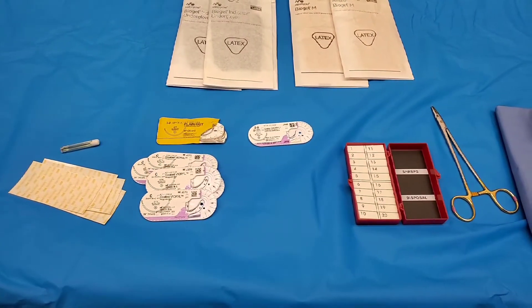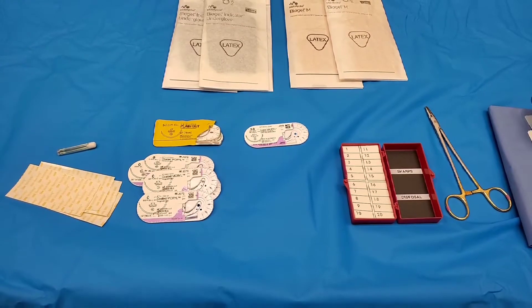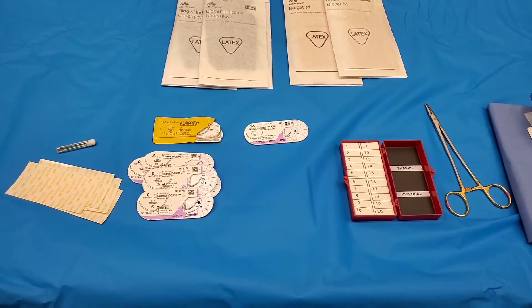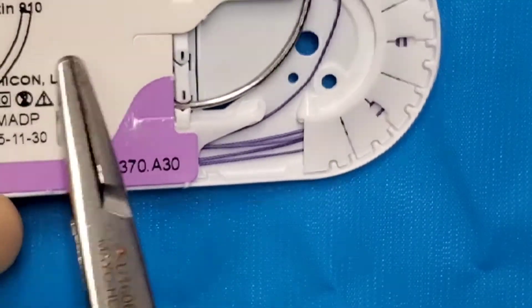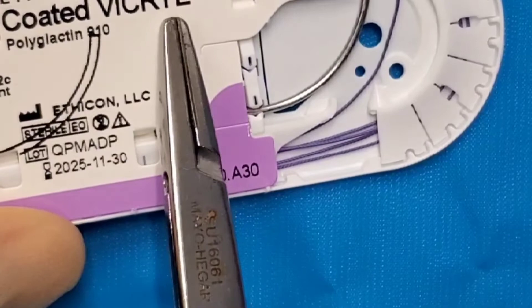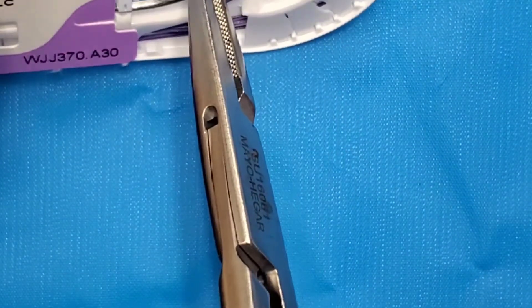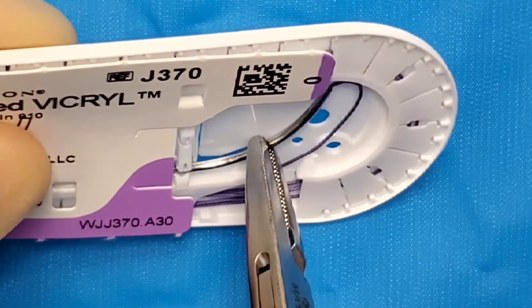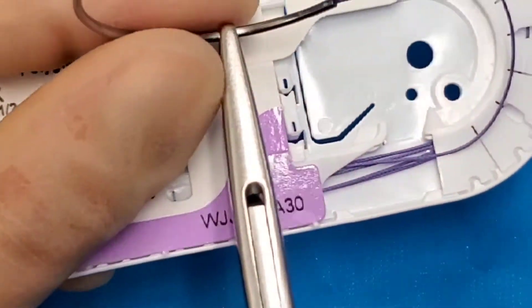Hey guys, in this video I'm going to show you how to load the needle driver with a needle from a left-handed and a right-handed. First, you're gonna take your suture, and to load it like a righty, all you need to do is just go straight and just adjust.